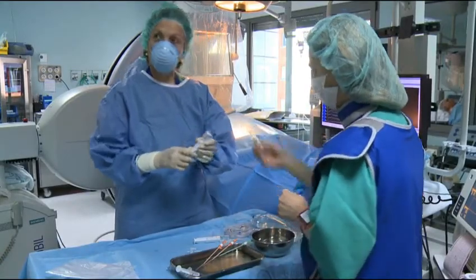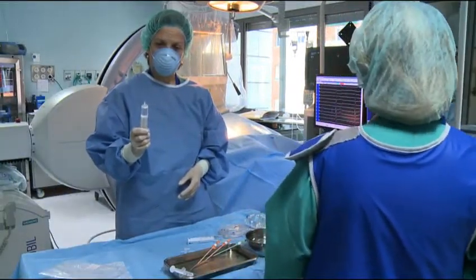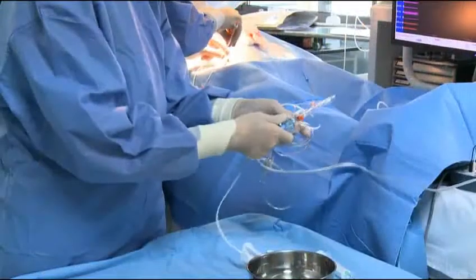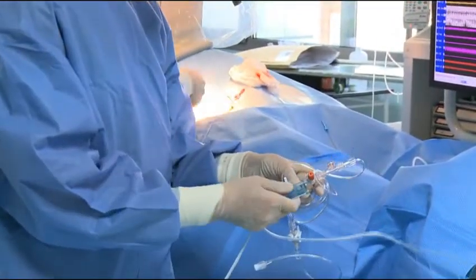Ahora lo que se trata es de acceder a las izquierdas a través de la arteria femoral para estudio de una taquicardia que se origina en el ventrículo izquierdo después de haber sufrido el paciente un infarto de miocardio.